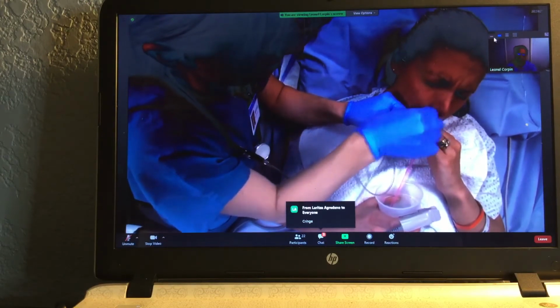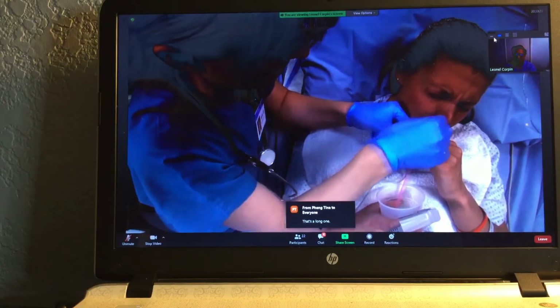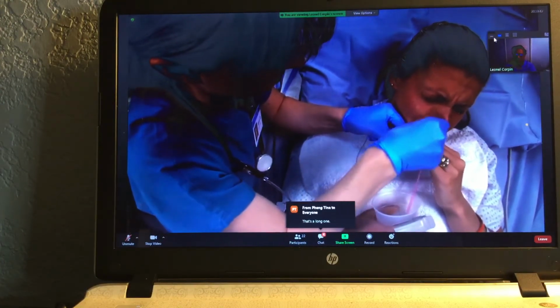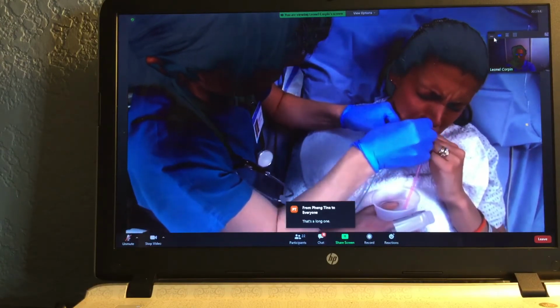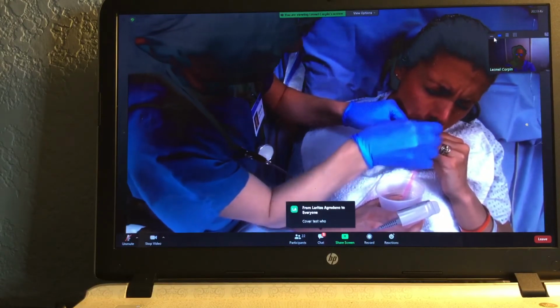If you meet resistance, significant coughing, gagging, choking, or changes to your client's vital signs, pull back on the tube until your client recovers. Keep swallowing.